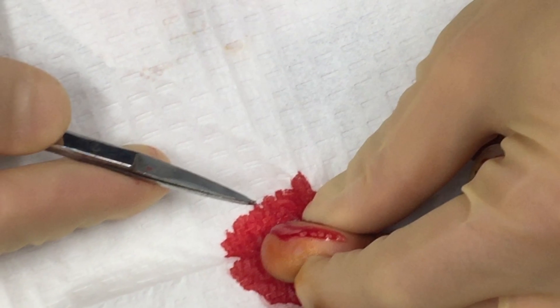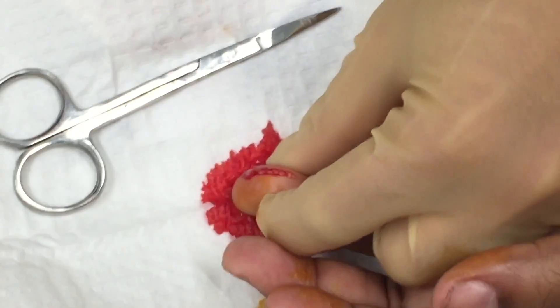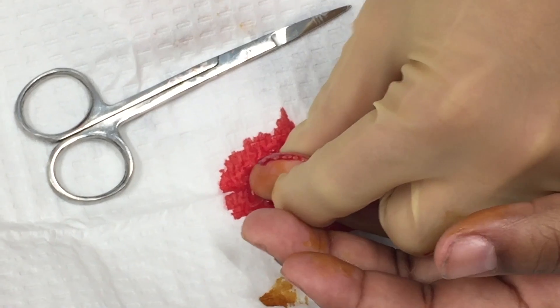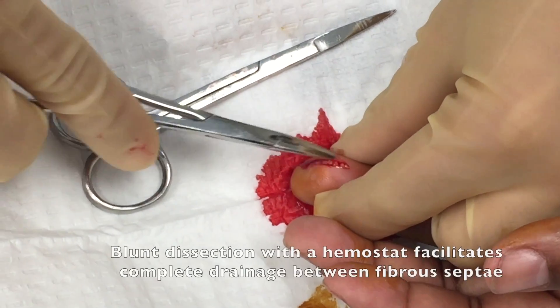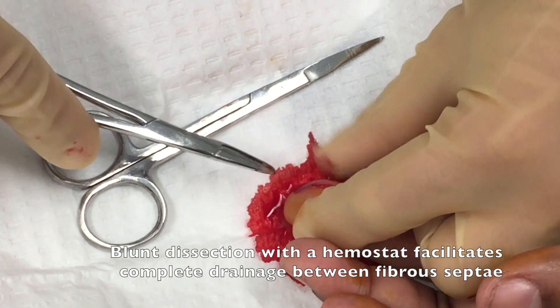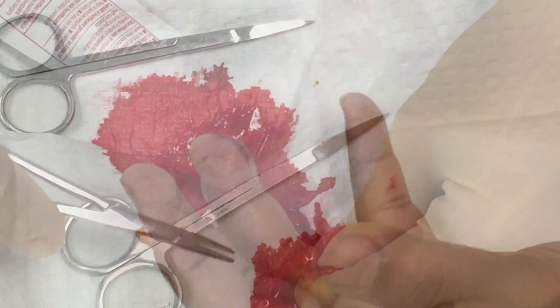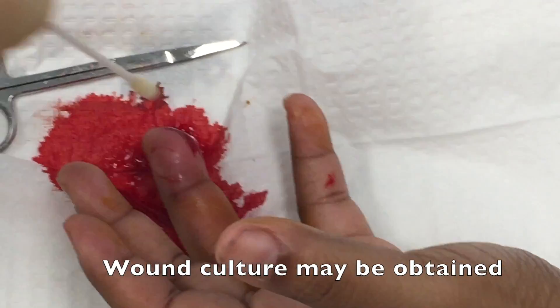I began to squeeze the fingertip and was able to express a small amount of pus coming out of the pulp of the finger, diagnostic of the presence of a felon. The next step was to bluntly dissect along the tissue planes, because remember there are many fibrous septae that exist in the fingertip pulp. If you don't dissect through all those septae, the infection won't completely drain.